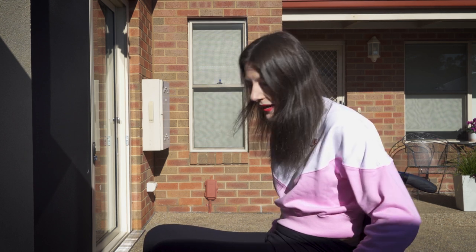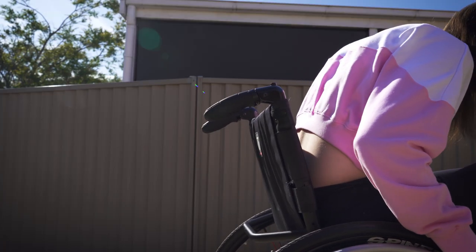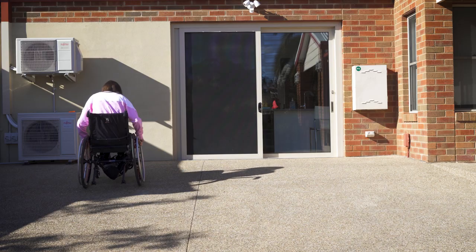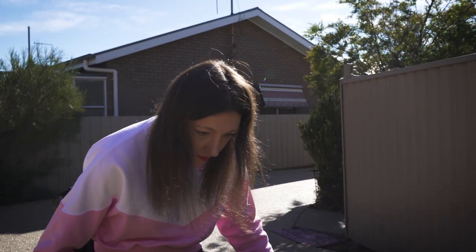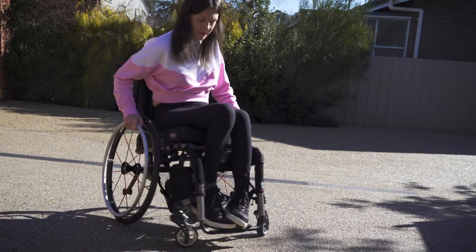It is very important that you lean forward when you are going backwards — lean forward like this. Make sure you are leaning uphill to reduce the likelihood of tipping over backwards. And because you are going backwards, please do frequent checks. This is very important because if you have to suddenly stop, there is a risk of tipping backwards. So always look where you are going.